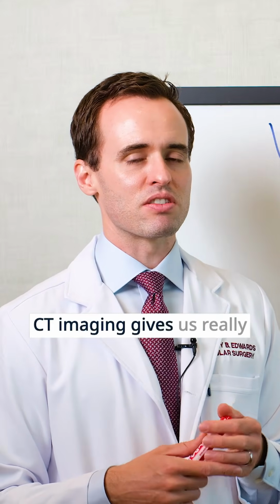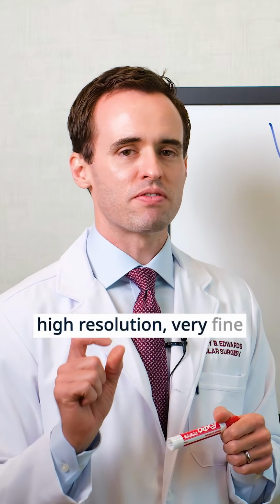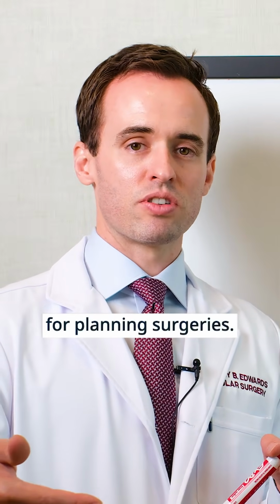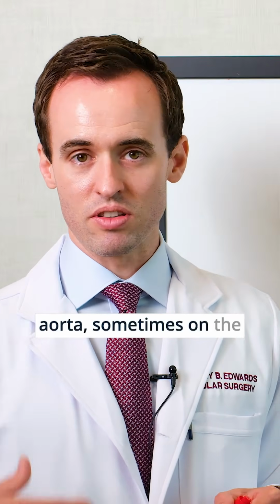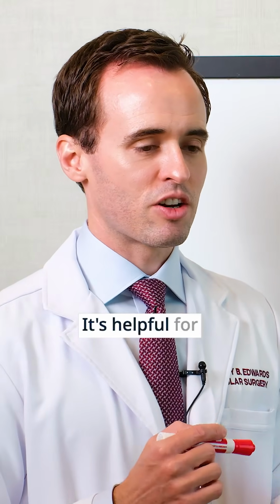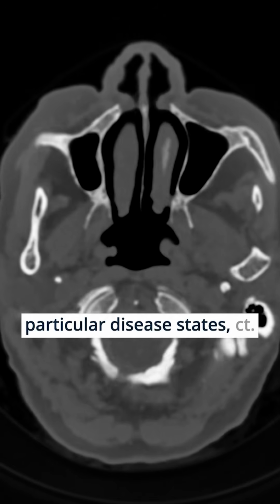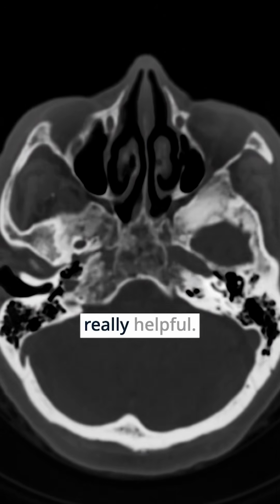CT imaging gives us really high resolution, very fine detail, and it's very helpful for planning surgeries, sometimes on the aorta, sometimes on the legs, on the carotid. It's helpful for understanding when the vascular anatomy starts to get really complex in particular disease states. CT imaging can be really helpful.